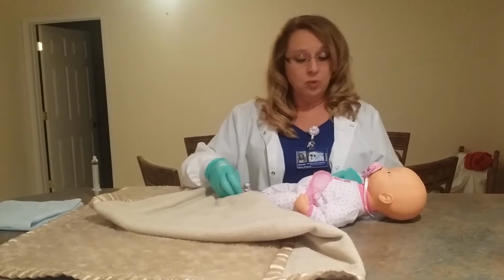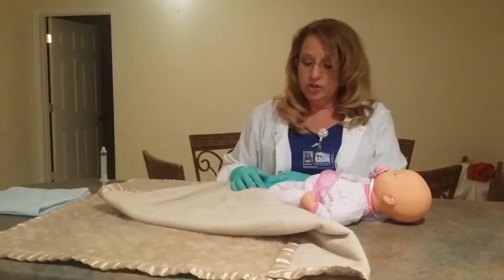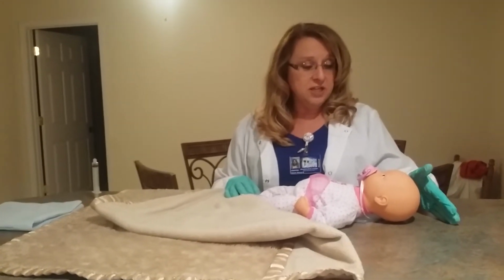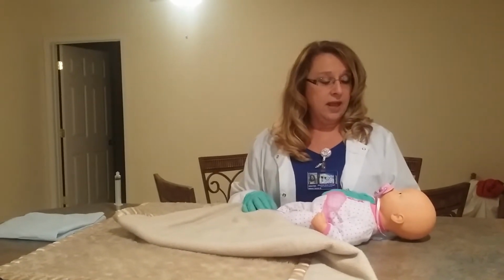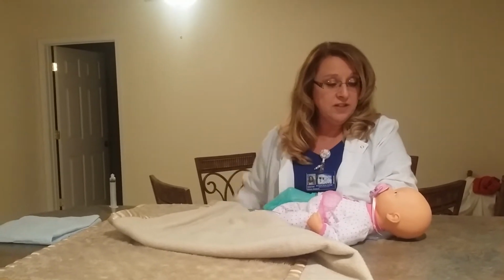Ms. Smith, today I'm going to be removing this Foley catheter, this tube that's going up into your bladder to drain the urine out. It's a relatively short, painless procedure. I need for you to inhale deeply and then let your breath out. Upon exhalation, I shall be removing the tube.